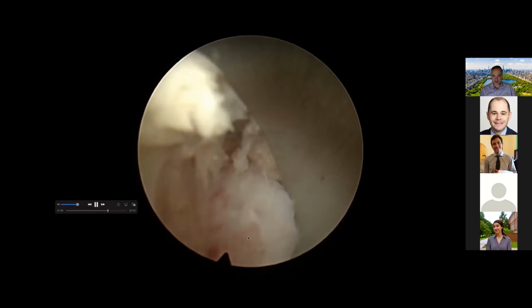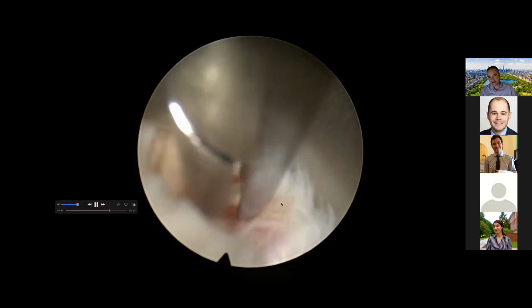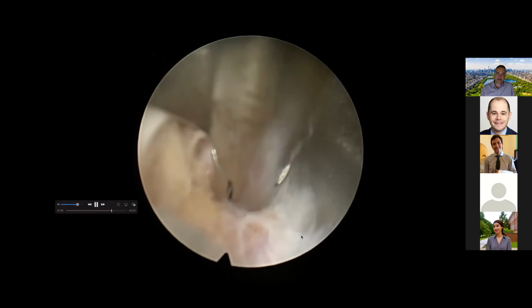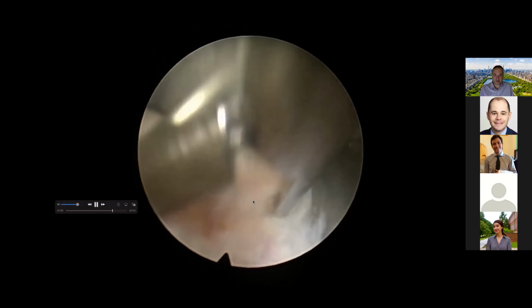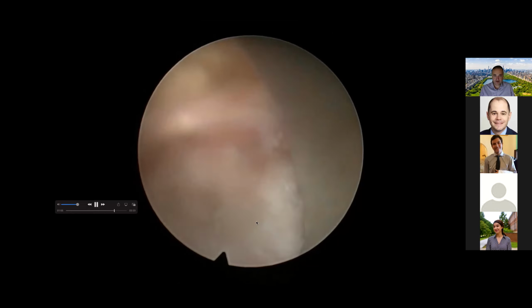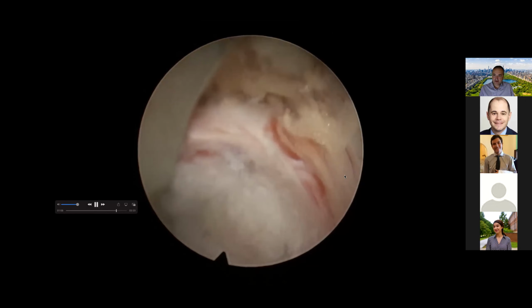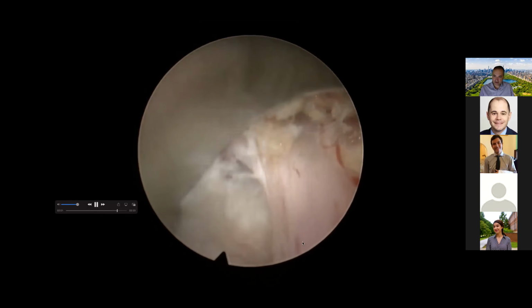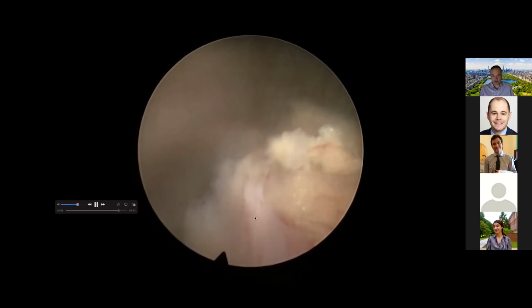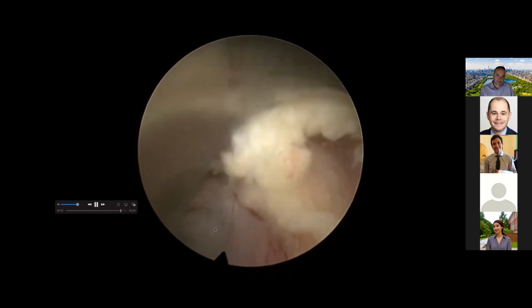And now the pathology, which is the herniated disc. You see how the herniated disc looks like cotton. That's very typical for herniated disc material. Then we proceed with the discectomy with this instrument, which is like a small pituitary rongeur. Again, we check here to make sure that everything is good with the nerve. So this pink structure is the nerve, okay, that we need to protect, and we need to work around it, or basically get in front of it to access the pathology.